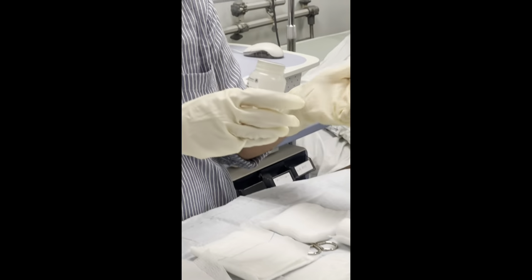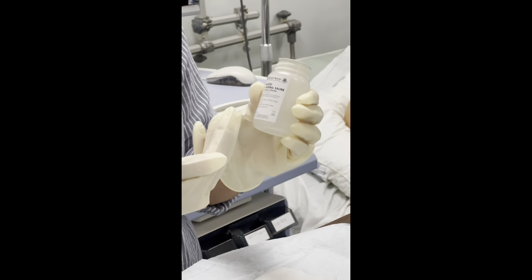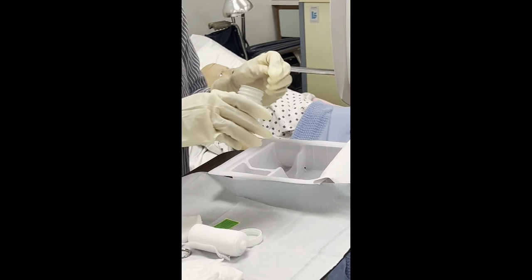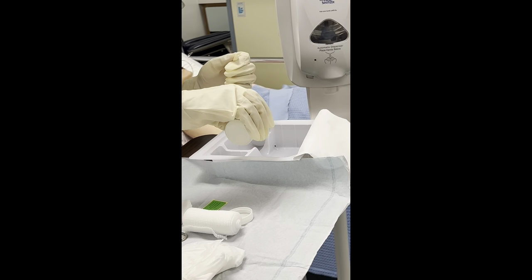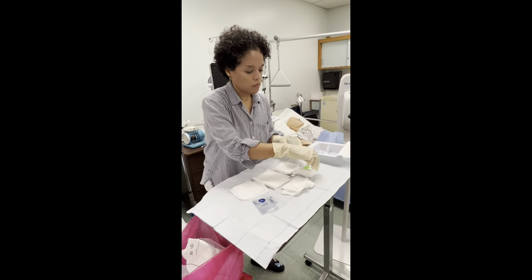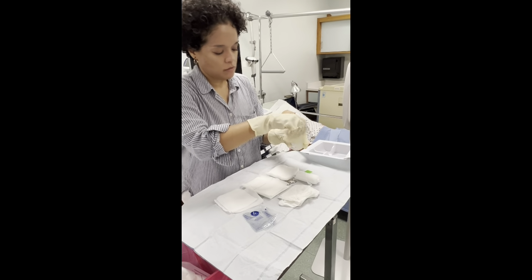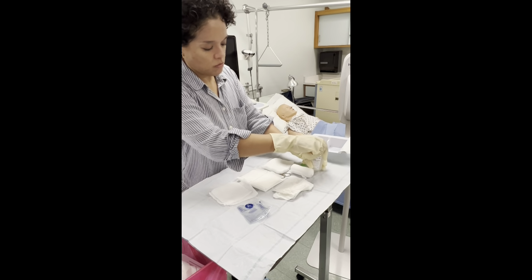So as you're pouring, if there's any small leakage, you don't want that to ruin the label of the solution here. Excellent. So I have the solution. I'm just going to be pouring. Okay. Close the container. Okay.